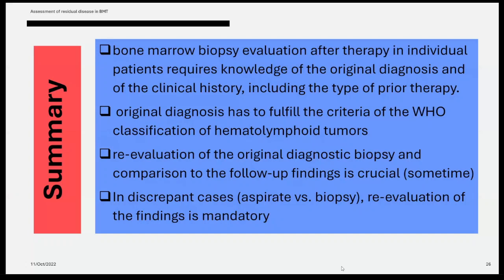So we haven't really observed the intensity of CD163 in those matured ones. But the articles mention that CD163 will stain the immature form. So probably in this case, we have to add in CD14, because CD14 and CD68 will stain different types of cell maturation, monocytic maturation. Okay.